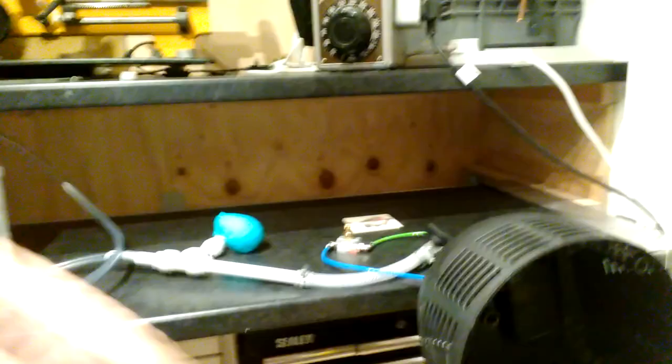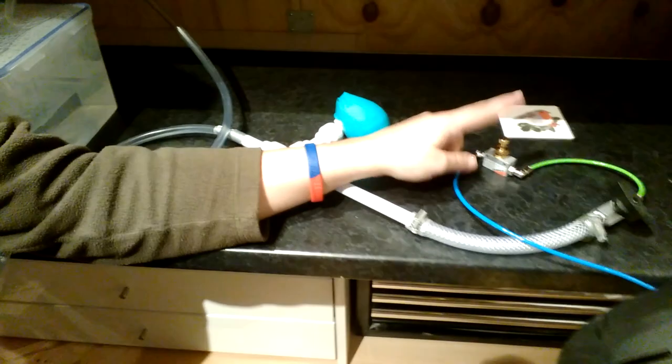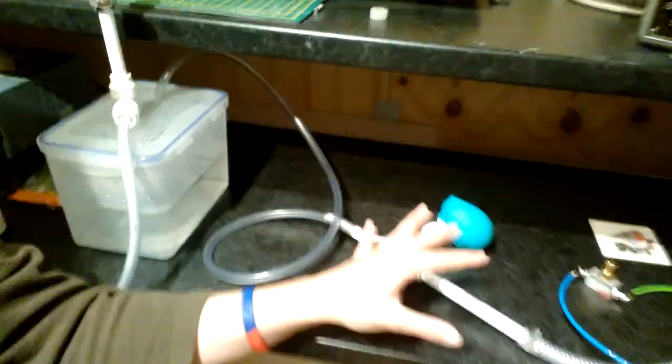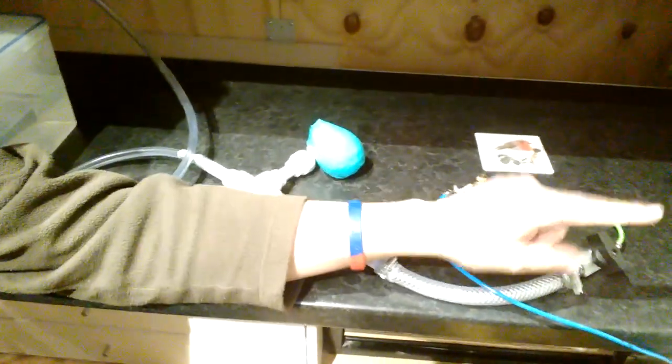Air from the cylinders then comes out through a pressure regulator, which I've got set to about 5 bar. Comes out through this hose, through this tube in here, through a valve which I can adjust to restrict the flow rate of air coming from the compressor into this setup here. This valve additionally is just a gate valve which allows me to close it or completely open it.